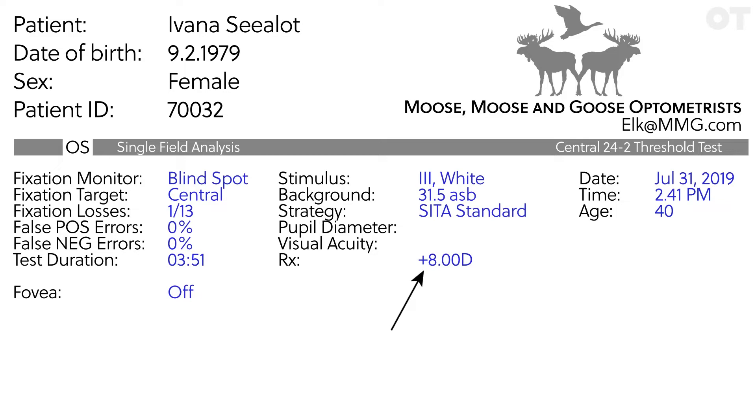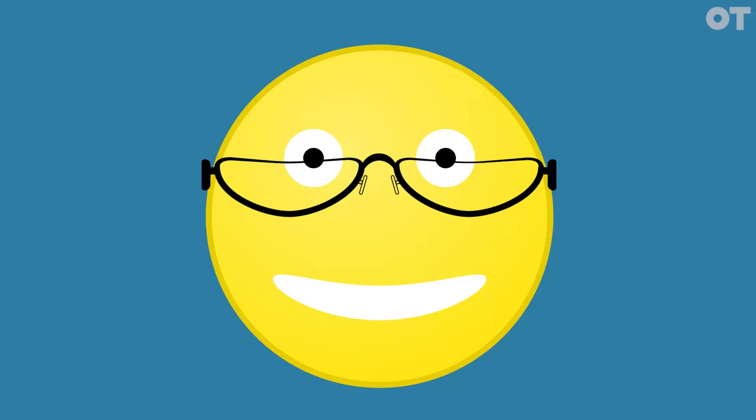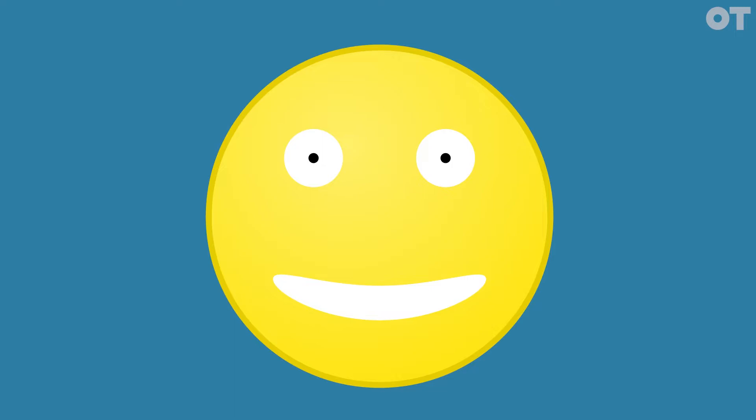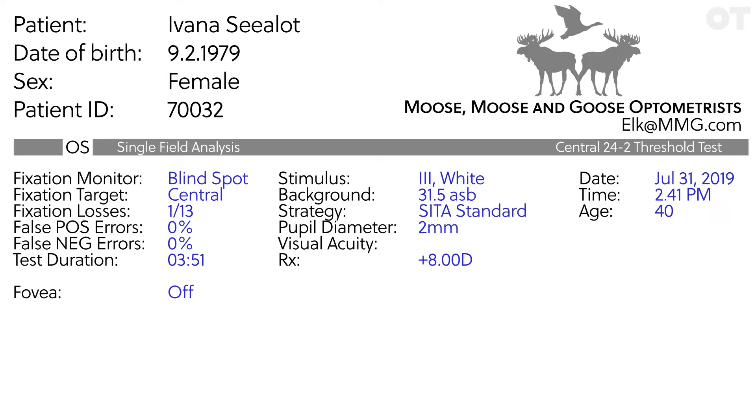A high plus lens could create a rim artifact. Did they use their own reading glasses and are they too small or sit too low on the face? Are the pupils abnormally small and could this affect the result?